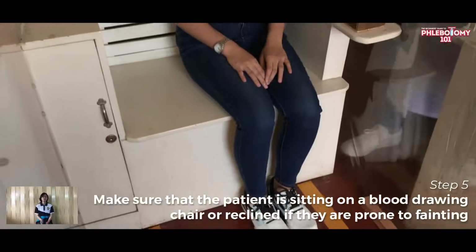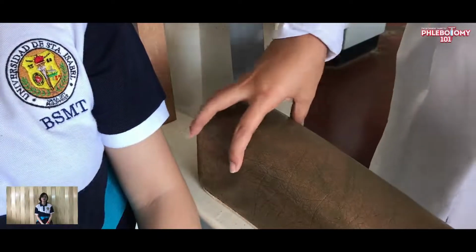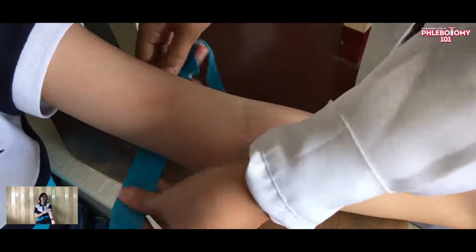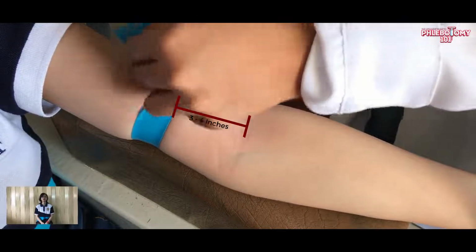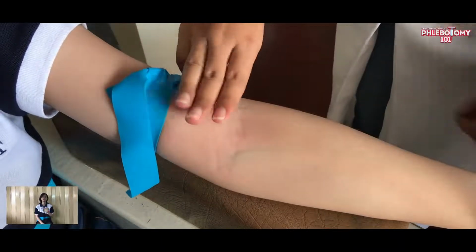Step 5. Make sure that the patient is seated on a blood-drawing chair or reclined if they are prone to fainting. Make sure that the patient's hand or arm is well supported. Then, apply the tourniquet 3 to 4 inches from the intended site, and if the patient has sensitive skin, apply it over a gauze. Never apply a tourniquet over an open sore because it is our job to aid the recovery process of the patient and not cause them any more harm.